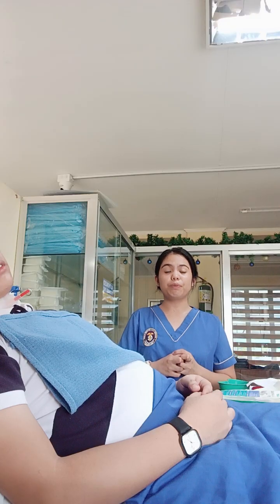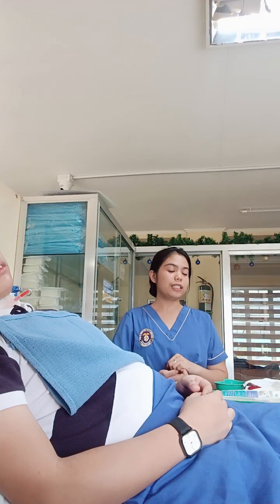mucus as well as any encrusted secretions in the tubings and the airway of the client itself. Also, to prevent any infection and further complications, and to provide patient comfort, safety, and care. So, first of all, before everything, we have to verify the doctor's order and assess the client's chart. And after that, we should always reassess first the client before any procedure.